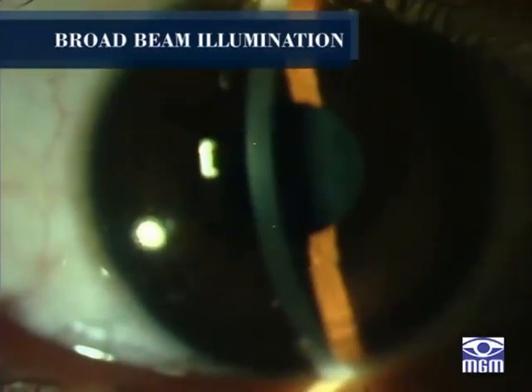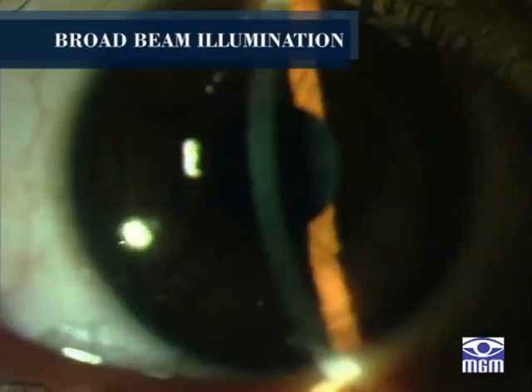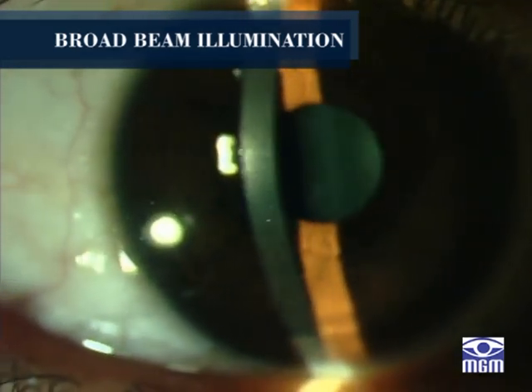Many conditions are best seen using broad beam illumination. The light should be applied tangentially for maximum effectiveness.